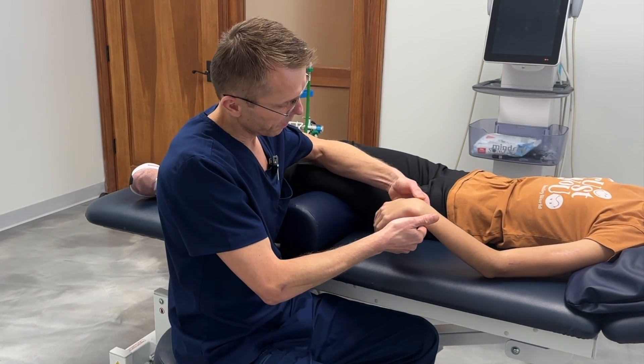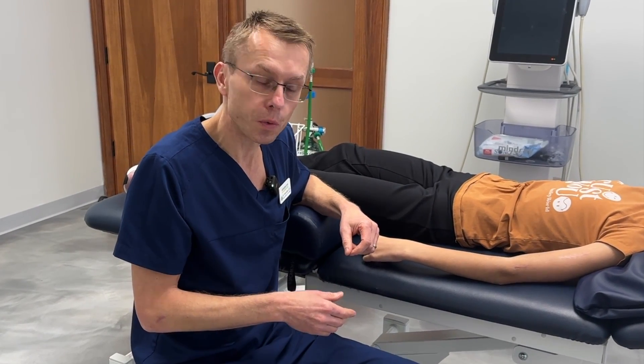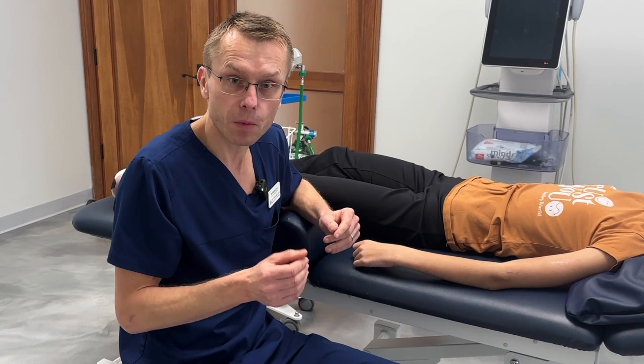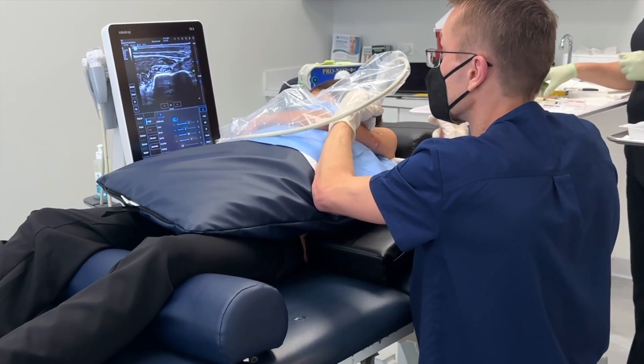Try to keep it up like this. So what we're going to do, like I mentioned, we're going to inject some PRP around the radial nerve and stimulate the nerve to start regenerating, and hopefully in the next couple of months we're going to see some function back. Now I'm going to go ahead and inject the PRP around the radial nerve.